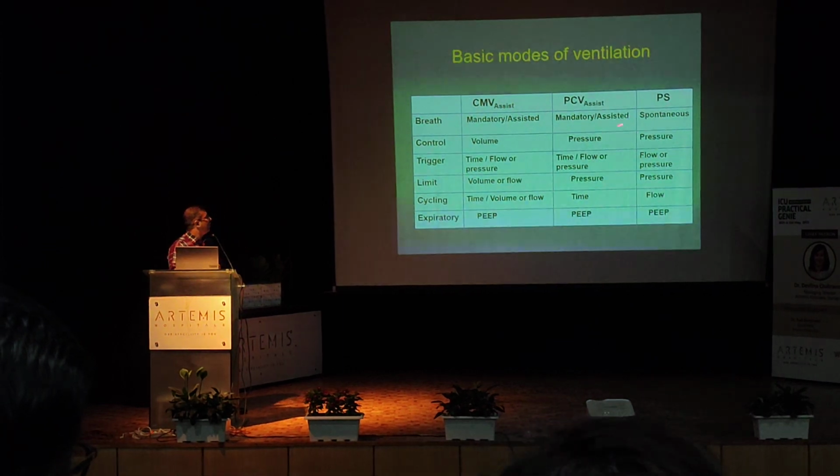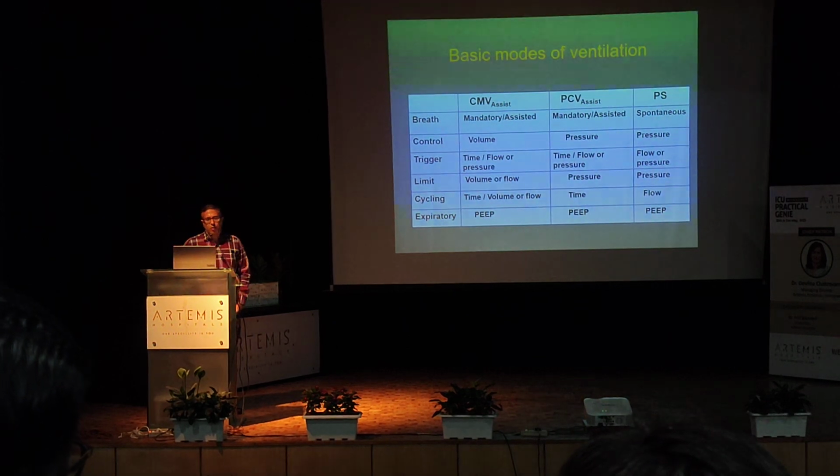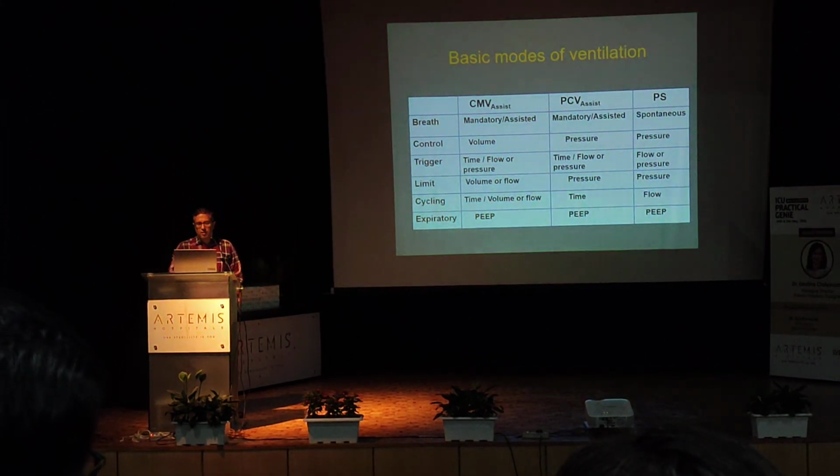In the pressure support mode, the breath is spontaneous, controlled by the pressure. Trigger can again be flow or pressure. The limit is pressure in this. Cycling is flow cycling. I will be showing the flow cycling in detail, and you have an expiratory PEEP.